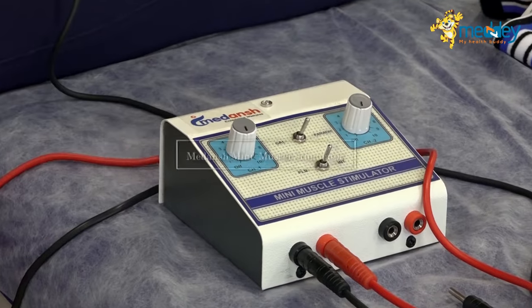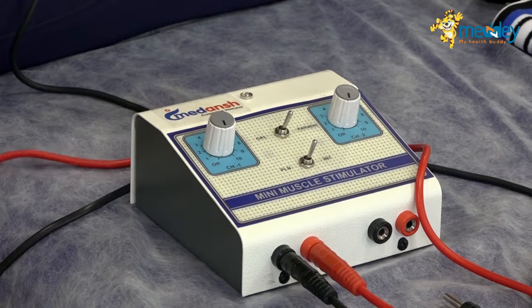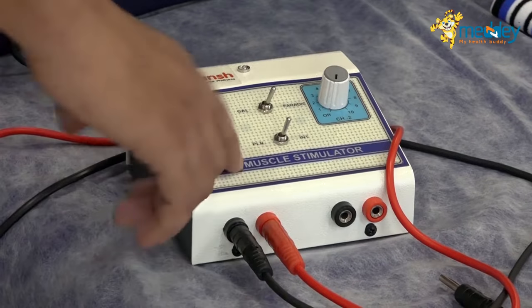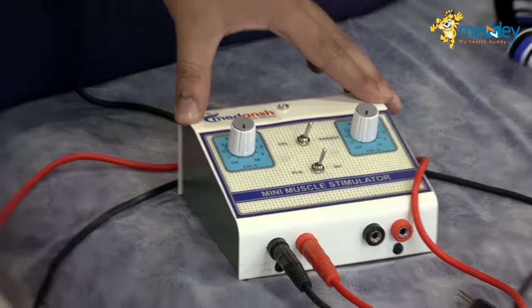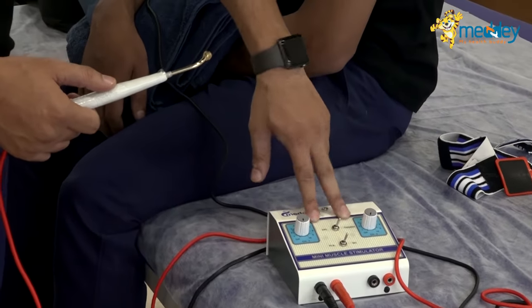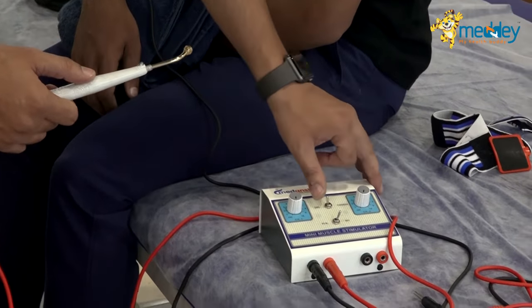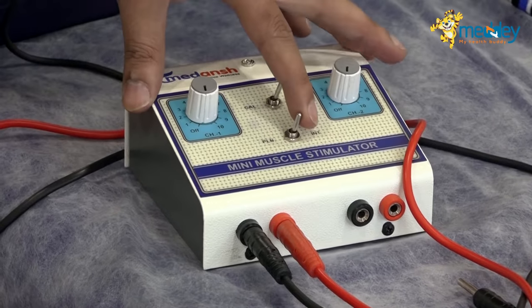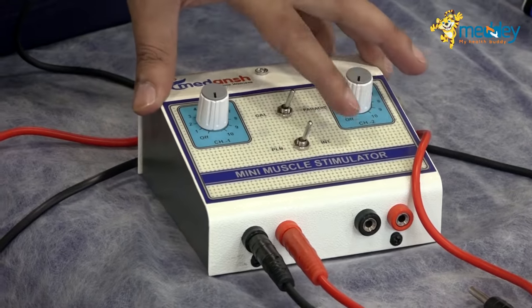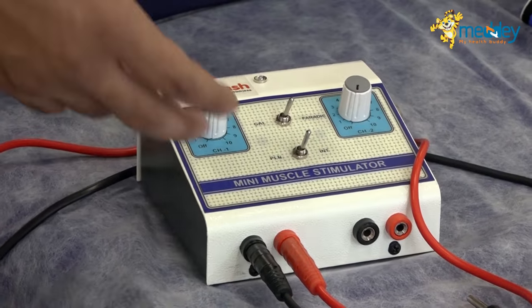This is a Medanj stimulator. There are two channels for electrode placement in the stimulator — one is galvanic and one is faradaic. If you keep it to the left it's galvanic; if you keep it to the right it's faradaic. You can also choose your current form, whether you want a plain or an intermittent current.